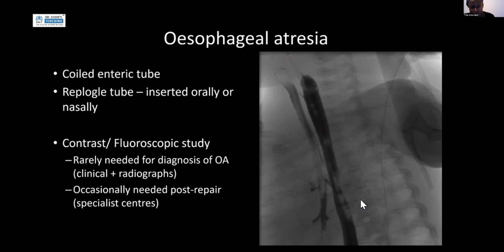Do you do them any differently, Sam? No, I think in my trust we don't do tube esophagrams, so we just do a routine swallow, because the surgeons say that. Yeah, and the reason for the tube esophagram, unless it's a very big defect, is that you want to give enough pressure, because some small tracts can be opacified with a normal swallow only if the pressure is high enough. So that's why you want direct injection under pressure. Yeah. So I think in recurrent aspirations and chest infections, the ones where we're looking for a really small tract, we'll do a tube esophagram, as Sam has suggested.